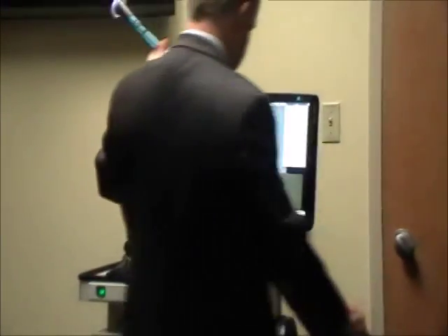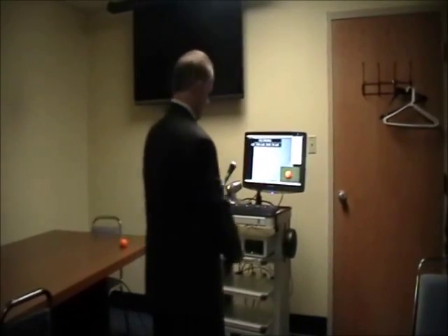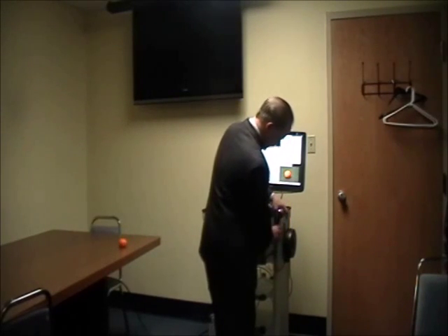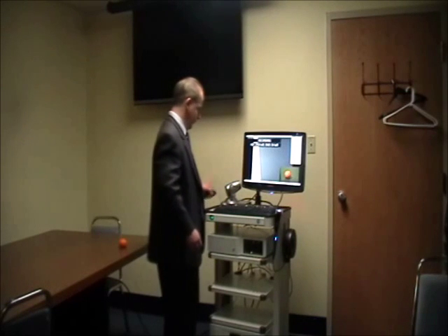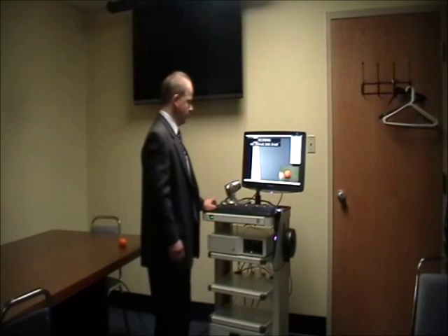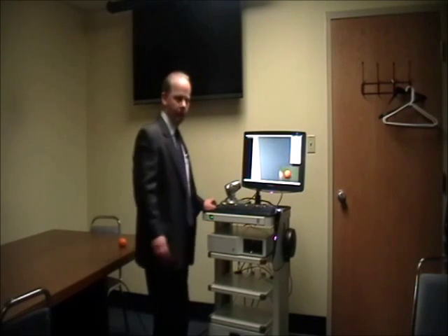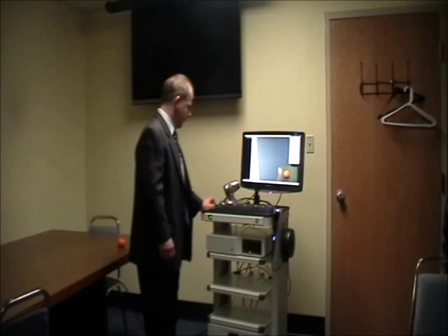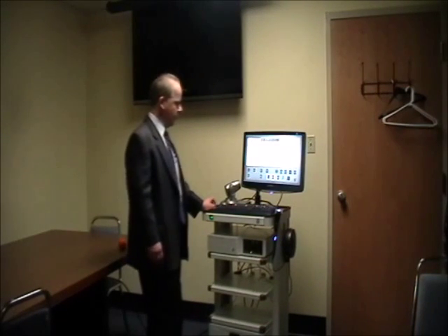and let's just say now we're done with the pictures that we needed to capture, and we're done with the video recording, and let's say we don't need the cameras anymore. We retract the reel back into its place, put the camera back where it goes. Now we want to review these images that we've just taken. So we can, oops, I forgot to stop recording, it looks like, sorry. Well, we now have our images and video that we have captured, so we'll move to this screen here.